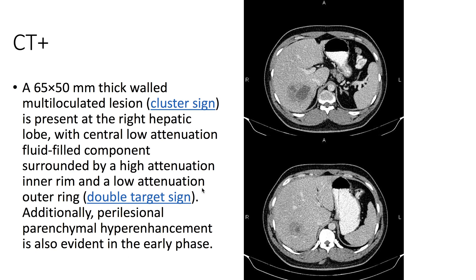On CT, we see a multi-loculated lesion which represents the cluster sign, present at the right hepatic lobe. We see that there's central low attenuation with high attenuation within the inner rim and low attenuation in the outer rim. This is the double target sign.